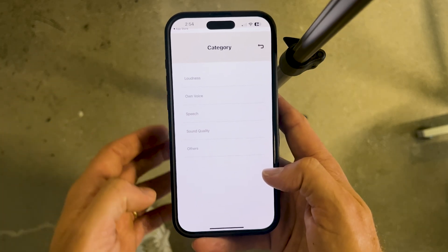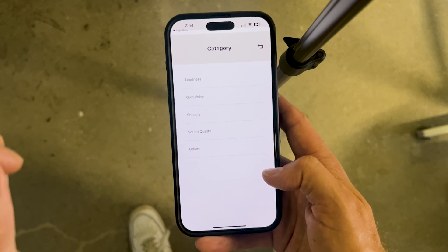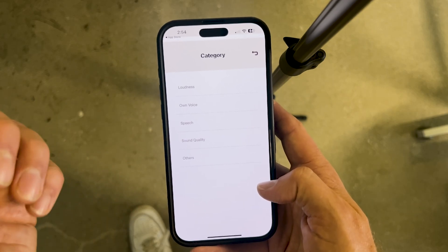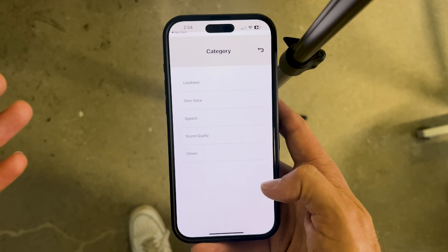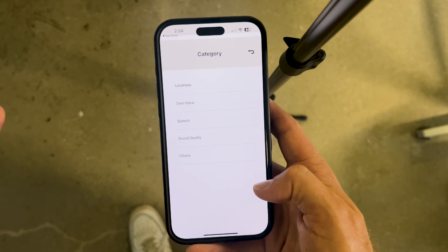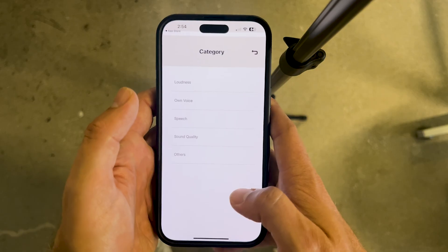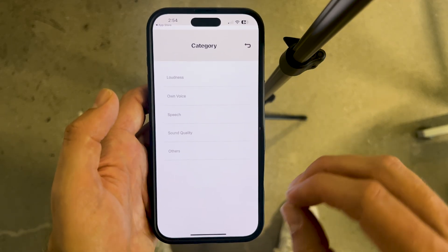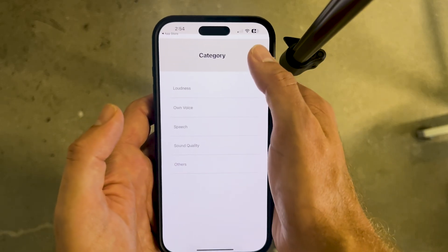There are several other categories you can dig into, including loudness — you could turn down the loudness if it's too loud — and sound quality, which lets you turn up the sharpness or get more roundness and bass. This is similar to the balance feature in the main remote control settings. You have lots of different functionality to unlock, and this is one of the hidden features in the Sony app that many people don't see. When they do, they find they're really able to customize these hearing aids to match their particular needs.